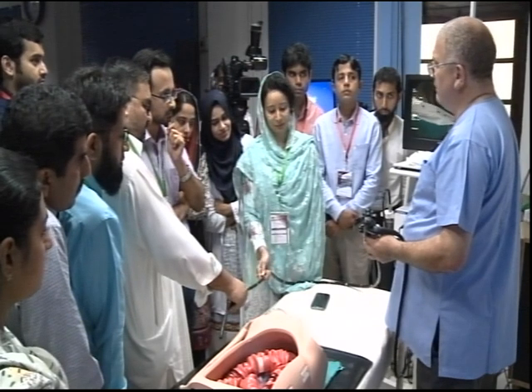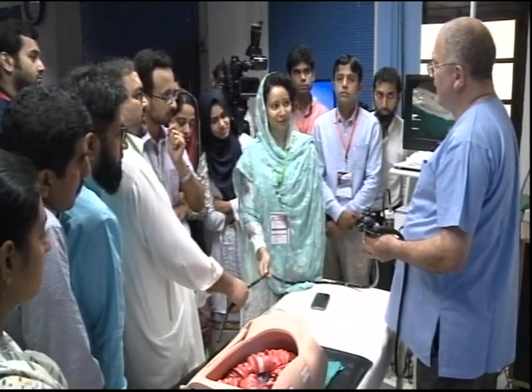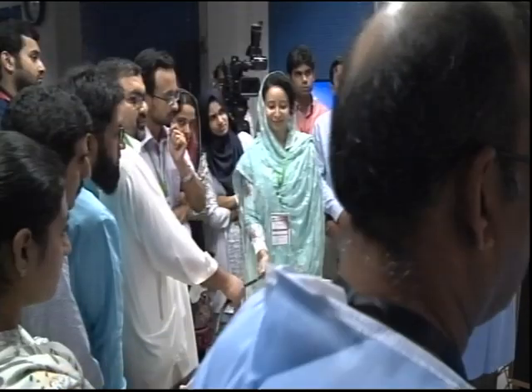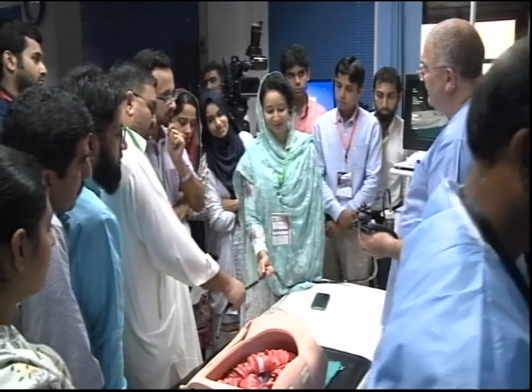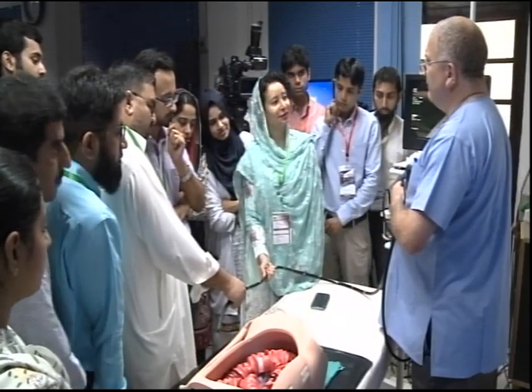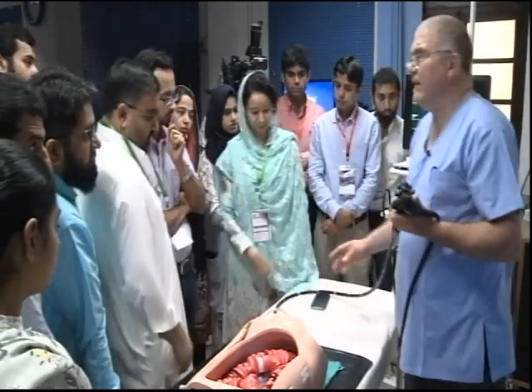Okay, so what should you do? It's stiff. But how are you going to make it rotate? Because you want to put clockwise torque on. Go on, keep it on. If I do that, how does that feel? Now it helps. Yeah. So what we're showing you, has anyone ever shown you that?